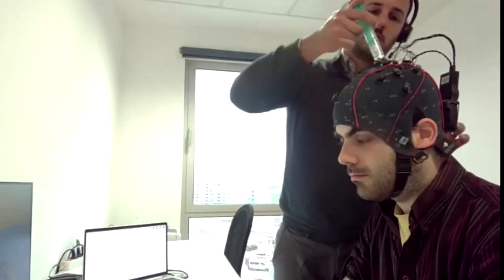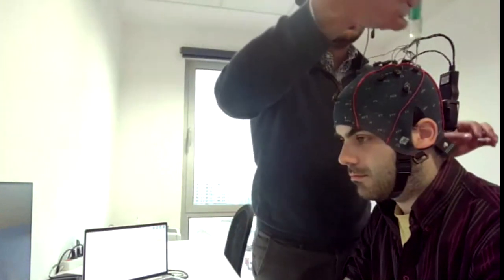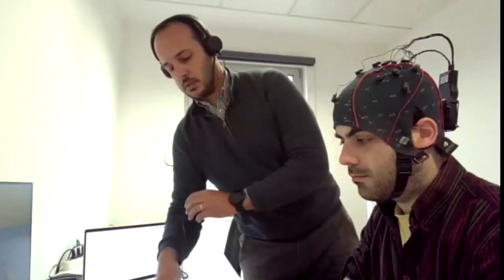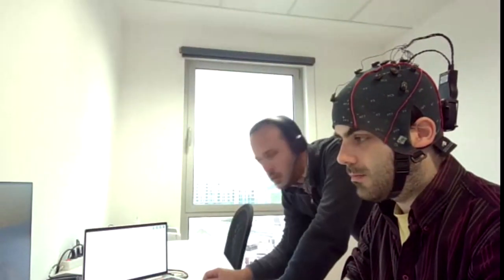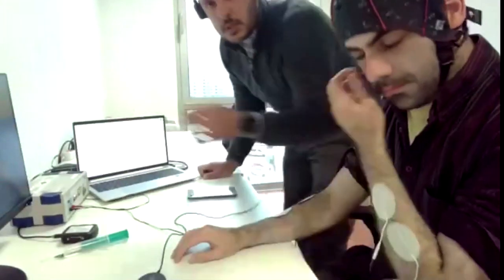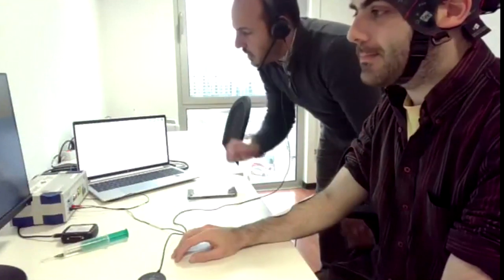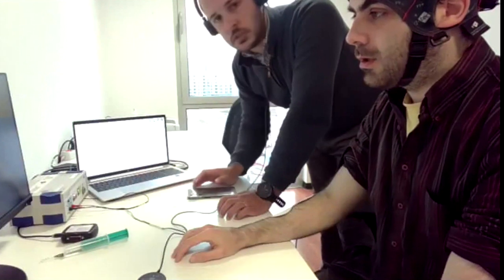So this method works for everybody. It doesn't matter if you have long hair or what. Maybe you need more gel if you have a lot of hair, but in general, it's working fine, a very easy way. I'm not sure if you can see now the EEG waves, but they are getting flatter, showing these small waves that I was showing you before in the presentation.